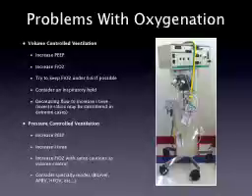I want to increase my PEEP first and then look at increasing the FiO2. If at all possible, I'd like to keep my FiO2 under 60% or 0.6. If this is failing, you can also consider an inspiratory hold, and we talked about doing that with a plateau pressure where I actually prolong my inspiratory time a little bit.